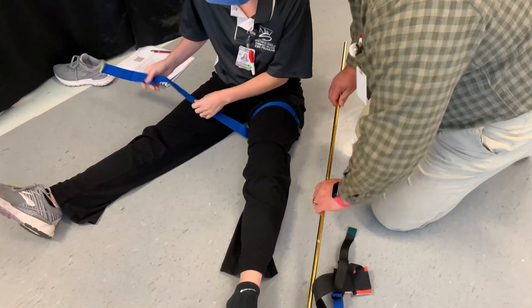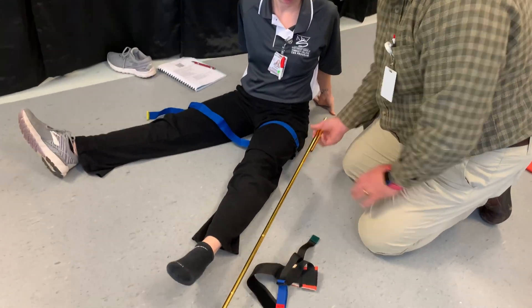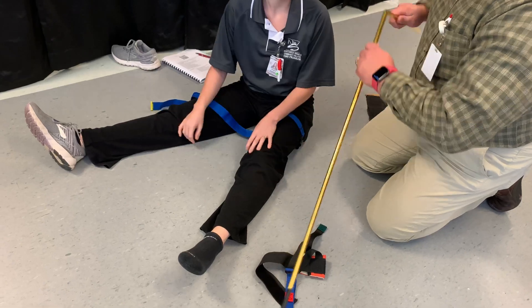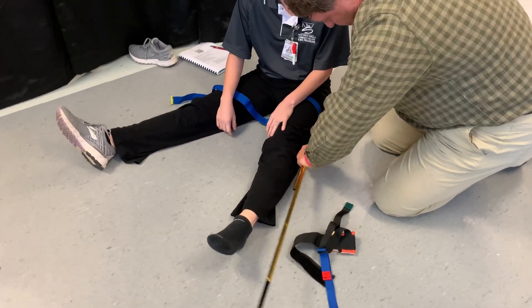We have that there, and we can then fold however many sections we need to make sure it's long enough. I'm going to go one more, I think, just so it's long enough, and then it'll slide into that.